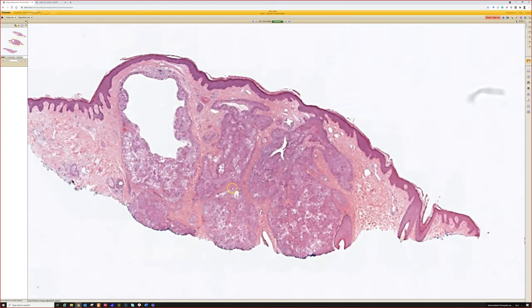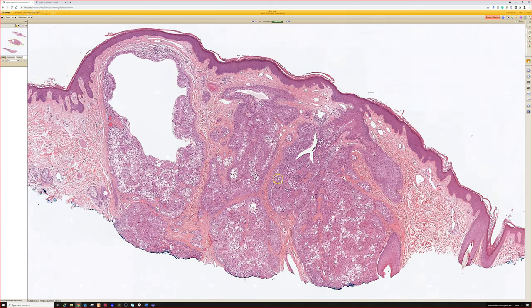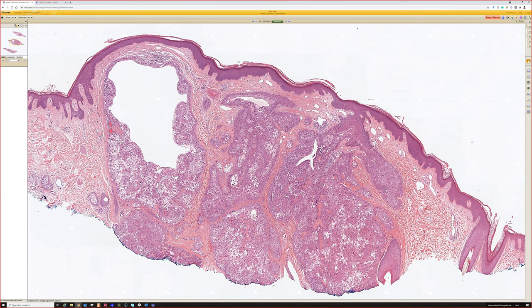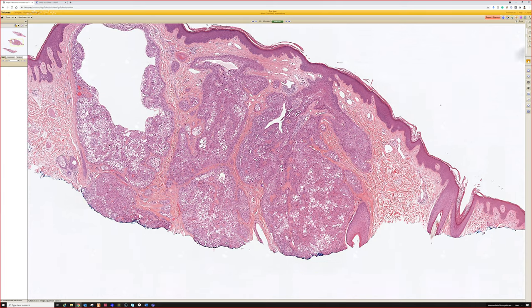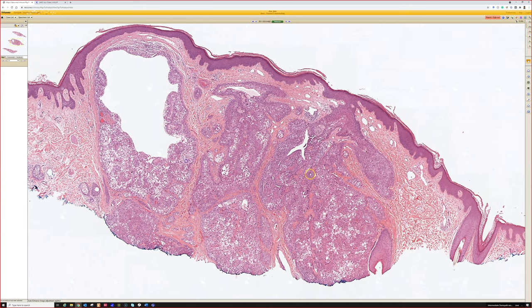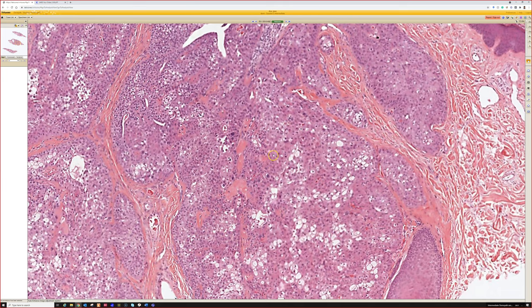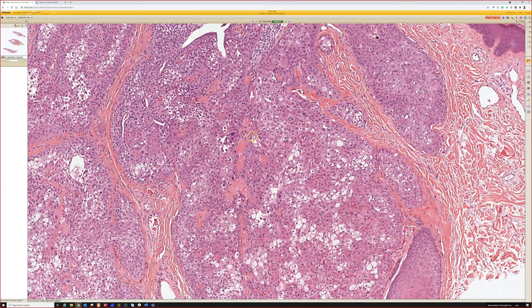Okay, what's this? Case 8. Yeah, another hidradenoma, very good. And you can add a lot of different adjectives to it if you want, like clear cell or nodular, nodular cystic, all those things work. And again, like I said earlier, acrospiroma is another name you can use for these. I tend to call them hidradenoma. I feel like nowadays, with the people I've worked with, that's a more well-known name.